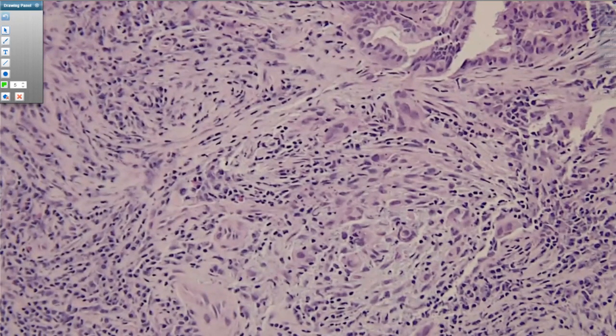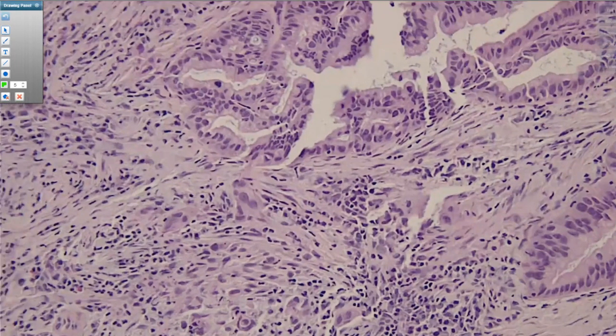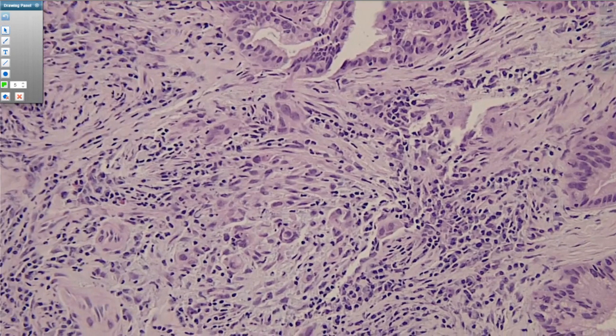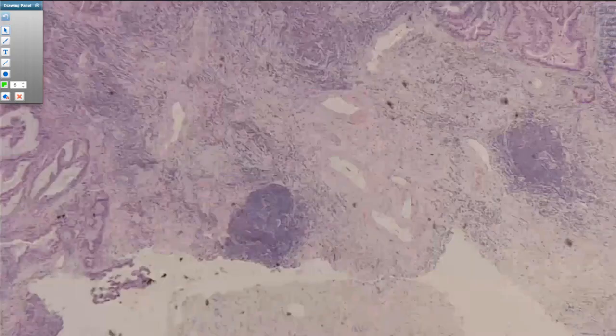And on the permanent, we were able to do a cytokeratin just to convince ourselves and highlight that there's no way these were strange macrophages or something. These truly were all epithelial. And the keratin really highlighted, again, the infiltrative and angulated growth of those cells. So this was an extremely small, less than 1 millimeter focus of invasion. The IPMN turned out to be the only one in the entire cyst, which is what was captured on that frozen section.